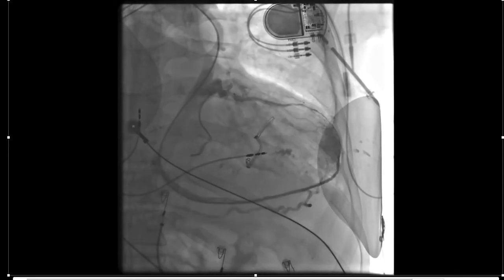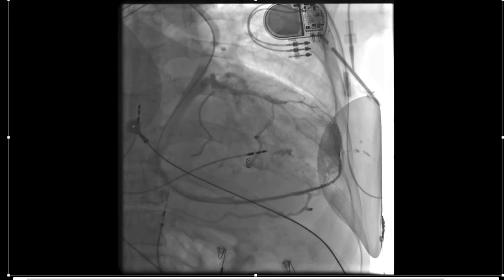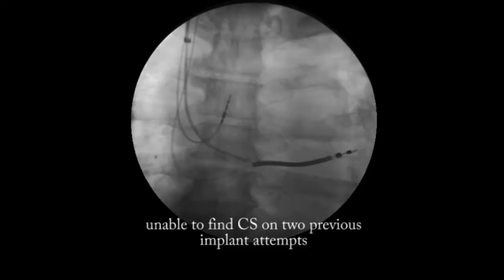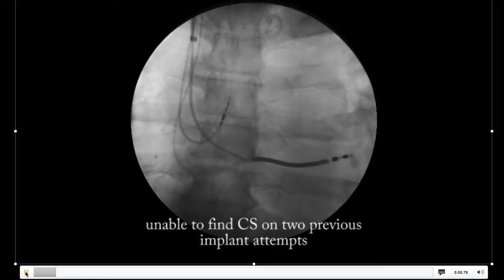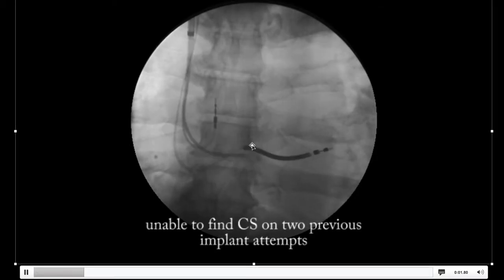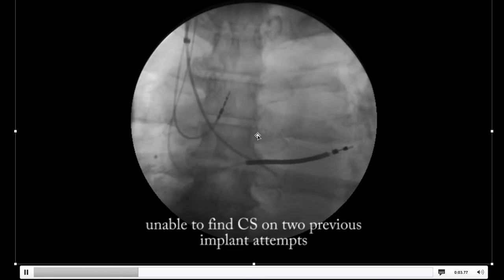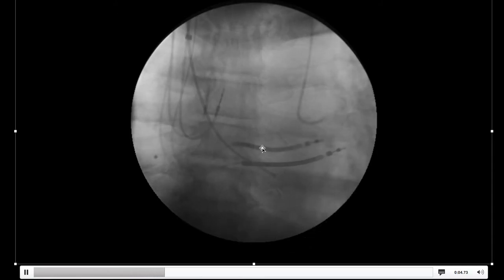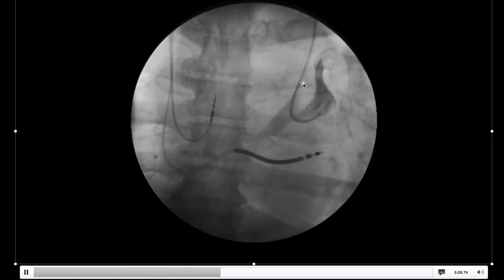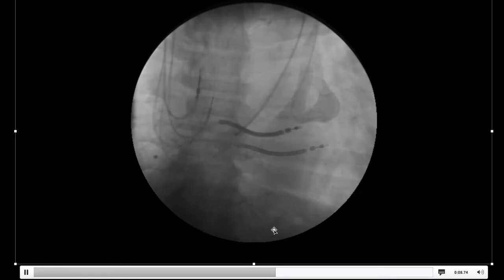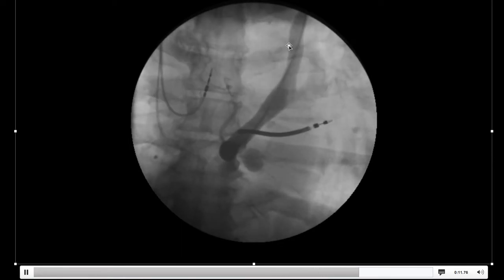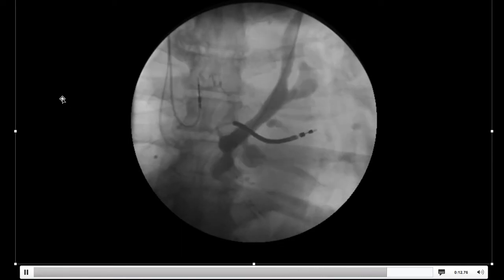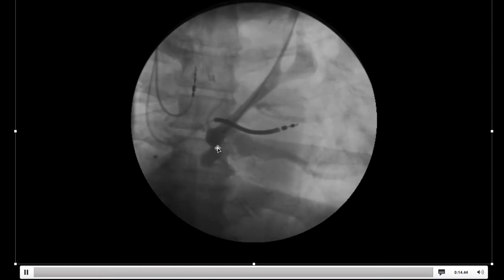In this case, it was possible to implant the lead down the persistent vein of Marshall. Just another example of a similar case where it was not possible to find the CS using contrast, and again, you can see that we were able to find a large vein of Marshall and implant down the vein of Marshall.